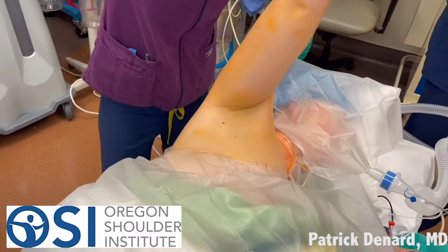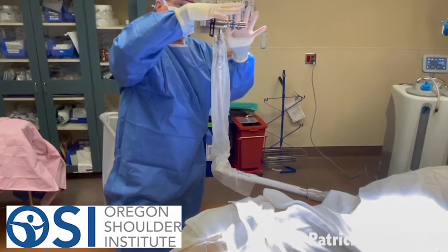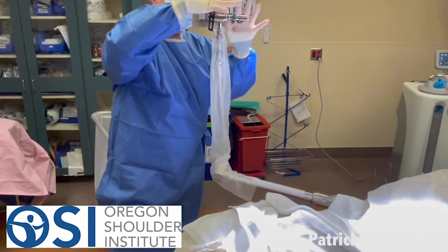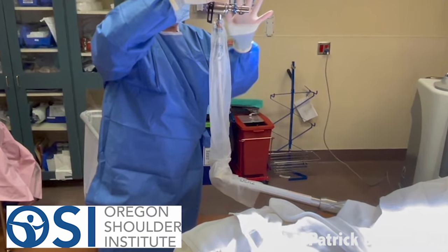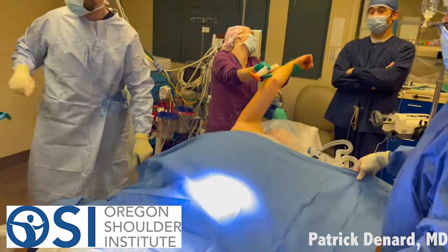We prep the entire arm — that's what that orange stuff going on is. And then we prep in the articulated arm holder. That allows us to position the arm in variable positions of abduction, adduction, internal and external rotation, and flexion. So we can get a full view inside the shoulder through a combination of the scope and this articulated arm holder.